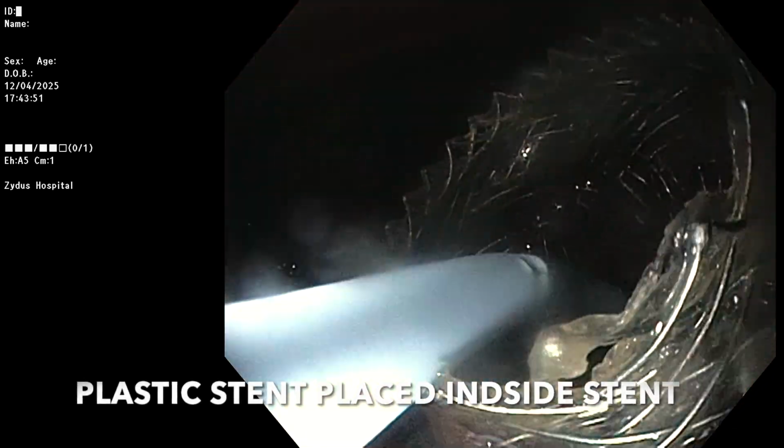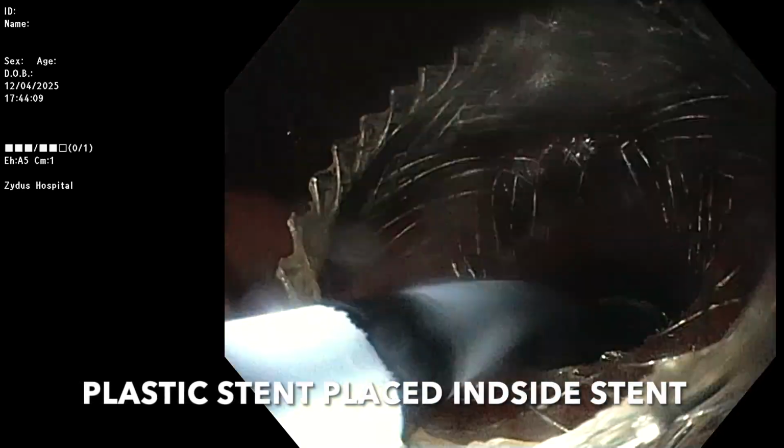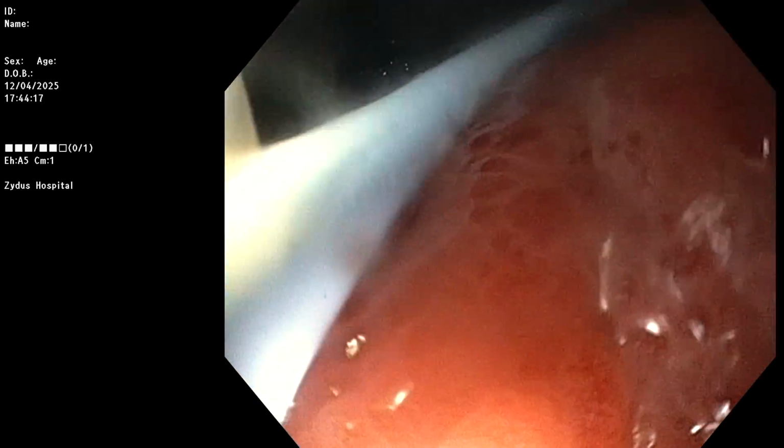Then after that, we always in our practice put a plastic stent inside this metal stent to avoid any kind of adverse event due to the metal stent.